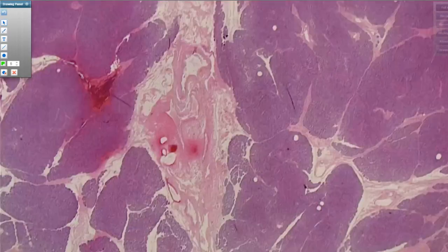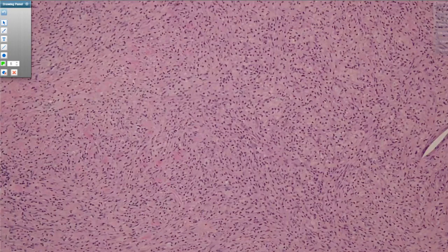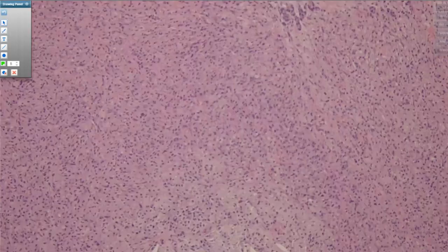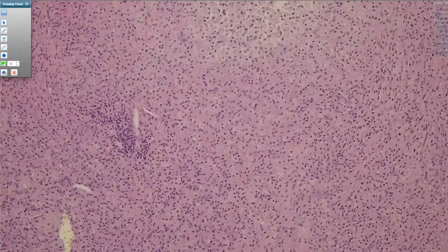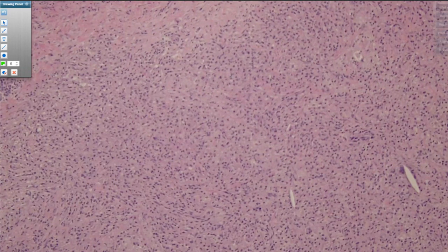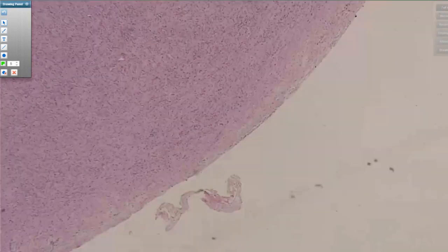I brought a section from this case of the pancreatic neck margin because you saw how extensive that inflammatory response to the degenerative changes in the cyst was. It actually extended all the way out to the pancreatic neck, which that particular day gave us a lot of strife because we had recently had a signet ring cell cancer sneaking through another pancreatic neck. And so it was nerve-wracking to see the cellular infiltrate, but in the context, you have all this cholesterol clefting, some of it's very clearly foamy macrophages, and you have that, again, nice unilocular cyst. You can see the degenerative changes on it grossly. And so within all that context, you're comfortable this is all just a reaction to the cyst, but that reaction can be very dramatic and can extend far from the cyst lining itself.